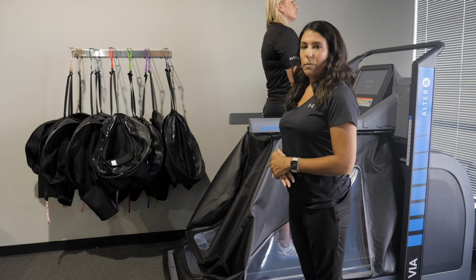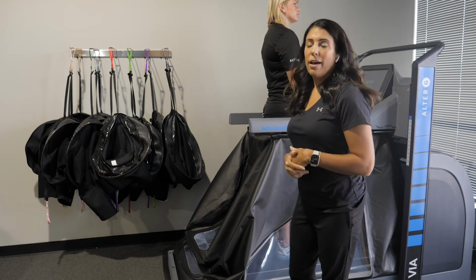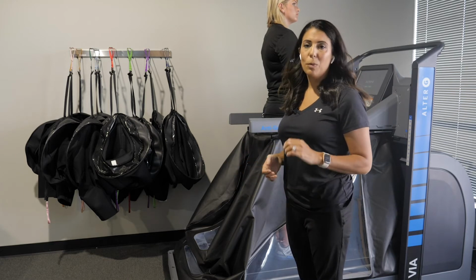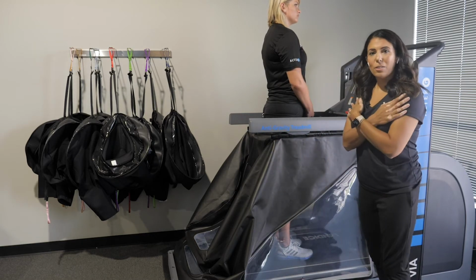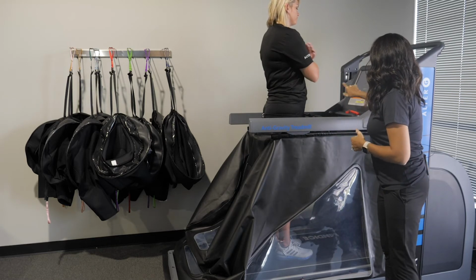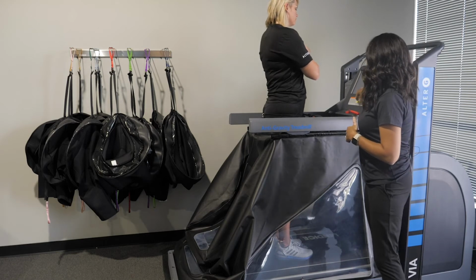So by pressing calibration, all we need the user to do is simply stand there with full body weight through their lower extremities. We ask that the patient try not to move too much, try not to support themselves on the rails, because that's going to create some unweighting, and we really want the accuracy to be there. So sometimes we tell the patient to cross their arms across their chest and simply press start session. It'll bring me to a little checklist, and I'm just going to tell it to start calibration.